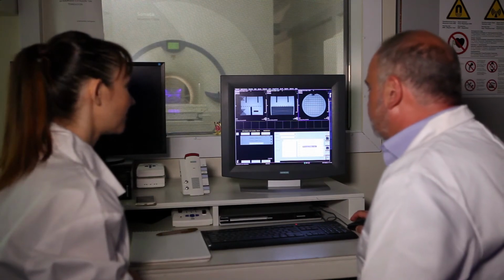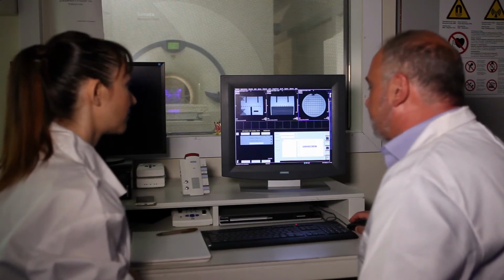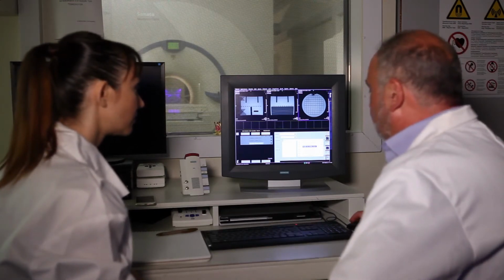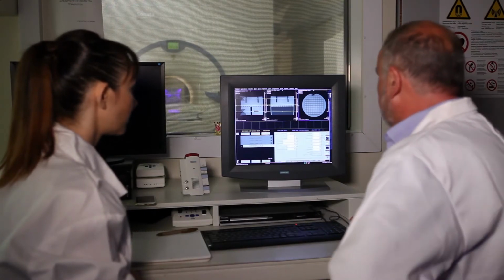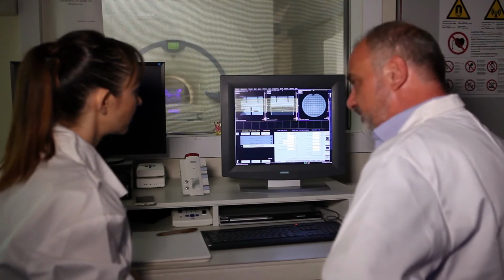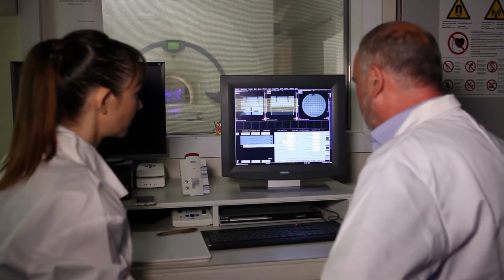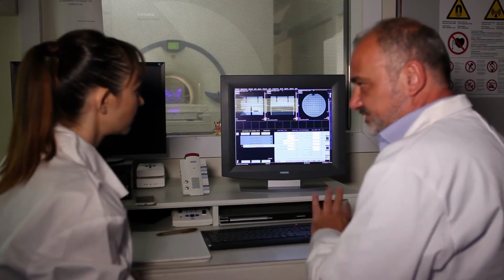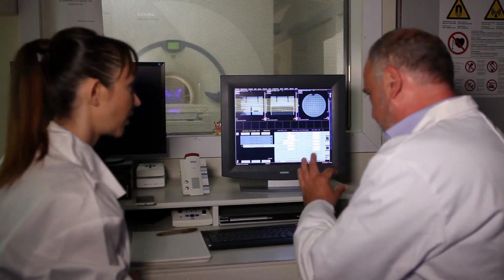The first measurements we have to do is to use the protocol of the ACR phantom. So you have to deal with 2 sequences, a T1 weighted sequence, spin echo, and a proton density, T2 weighted, double echo. Okay? The T1 weighted is a standard spin echo sequence, which is a multi-slice sequence. You're going to see the slices here. There it is. According to the manufacturer of the phantom, you have 11 slices of 5 millimeters thickness, with a gap of 5 millimeters. This is 100% gap, as designed in Siemens. But anyway, you have a 5 millimeter slice and a 5 millimeter gap in the slice interval.